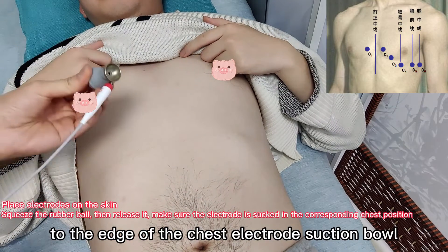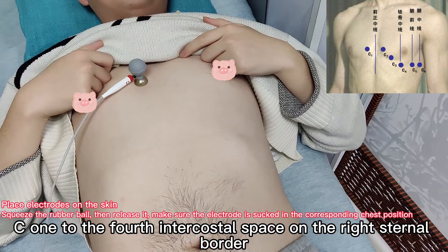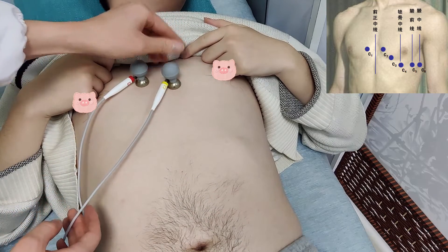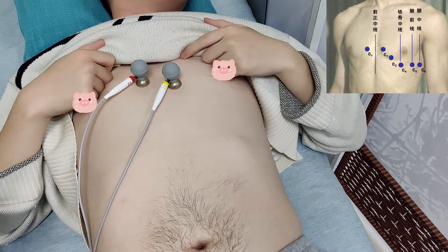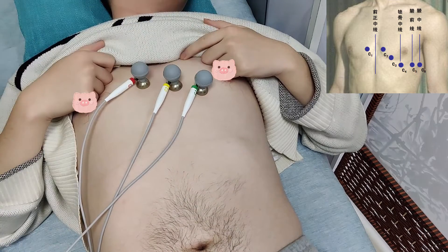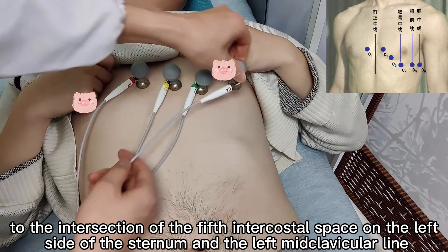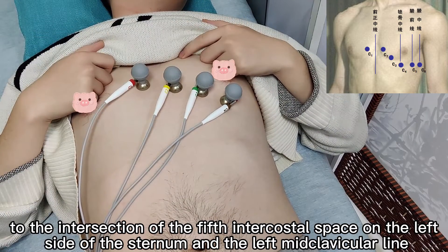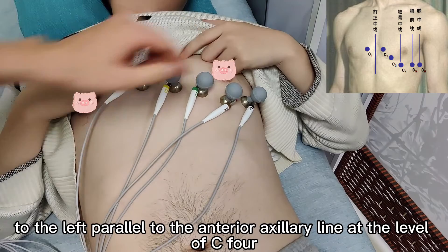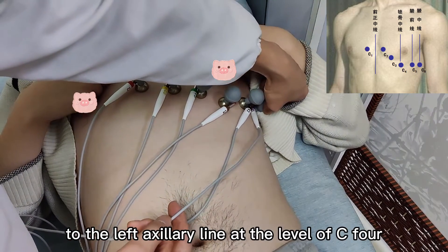Apply conductive paste to the edge of the chest electrode suction bowl. C1 to the fourth intercostal space on the right sternal border. C2 to the fourth intercostal space at the left sternal border. C3 to the midpoint of C2 and C4. C4 to the intersection of the fifth intercostal space on the left side and the left mid-clavicular line. C5 to the left, parallel to the anterior axillary line at the level of C4. C6 to the left axillary line at the level of C4.